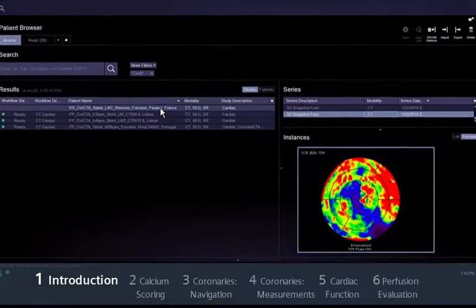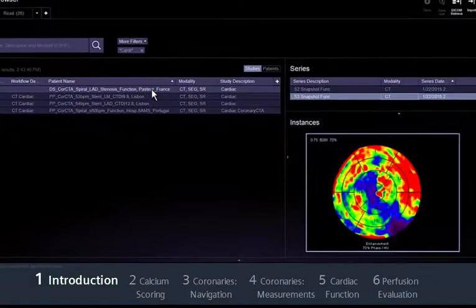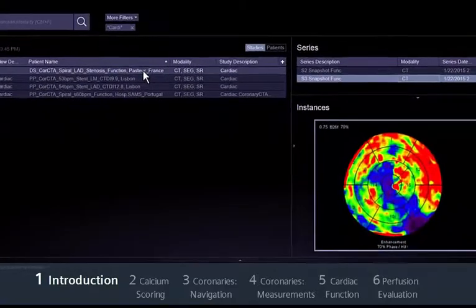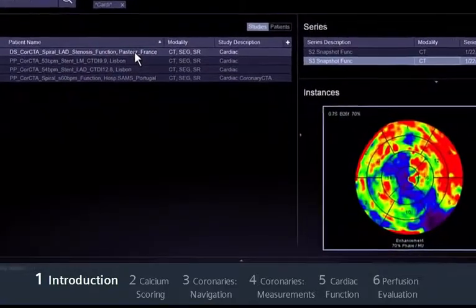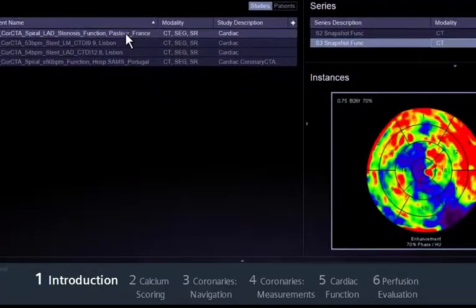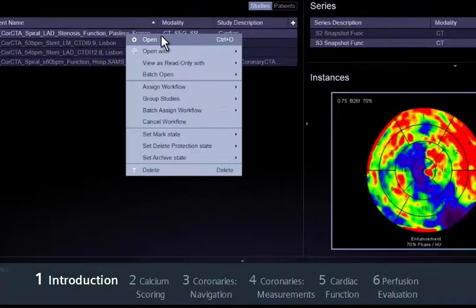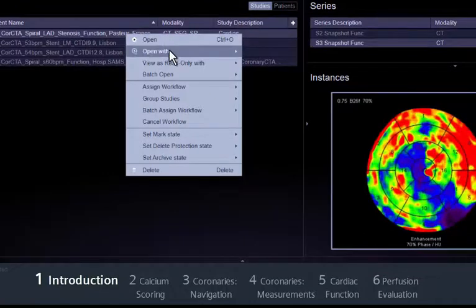First, make sure that the study is correctly assigned to the CT cardiac workflow. If it isn't, right-click on the study and select 'Open with CT Cardiac.'